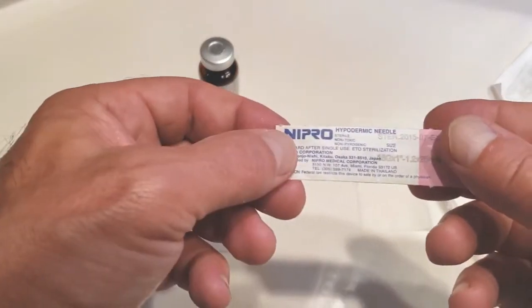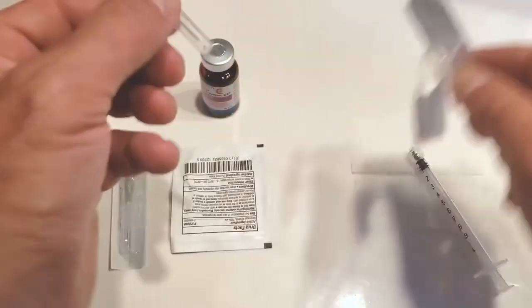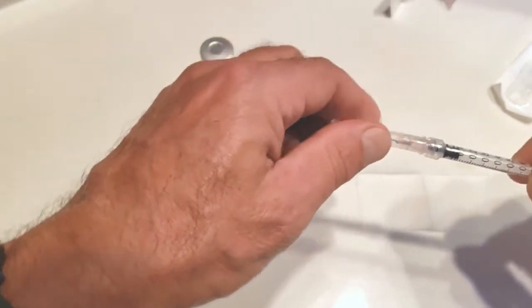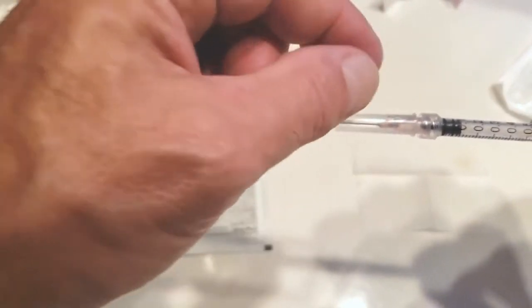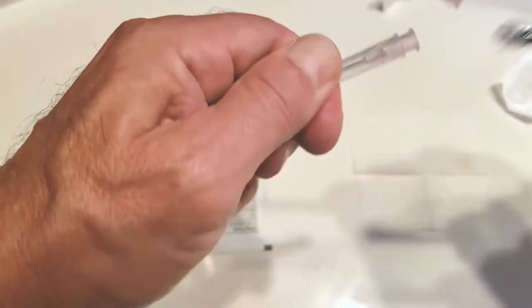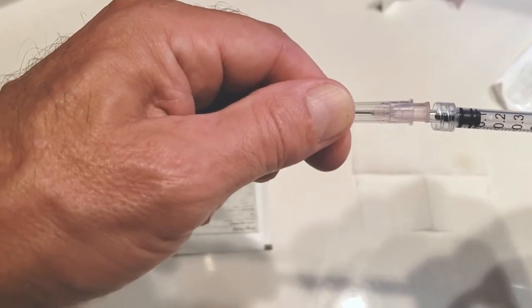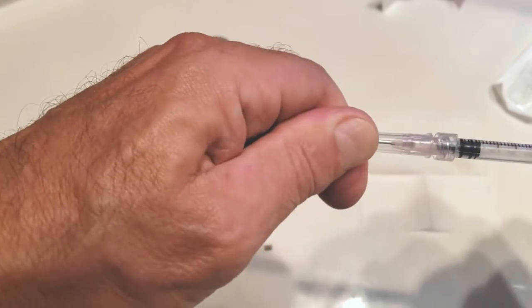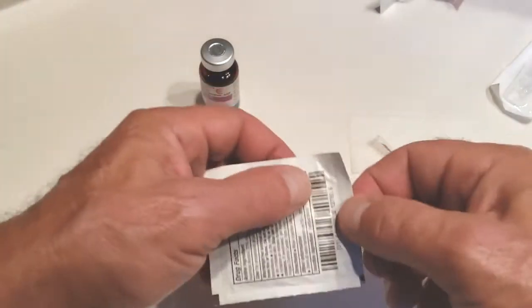This is an 18-gauge loader needle. 18-gauge is fatter in diameter and good for loading the viscous testosterone cypionate. I place that without touching anything to the luer lock or the hub of the 18-gauge. The pink hub is sterile — sterile touching sterile. I twist and secure, then set this back down on my sterile pad.